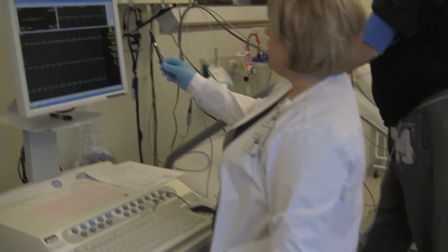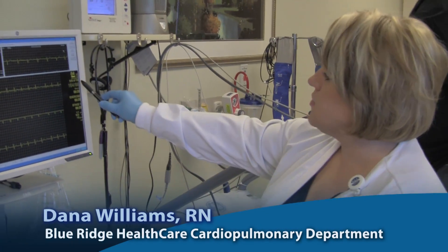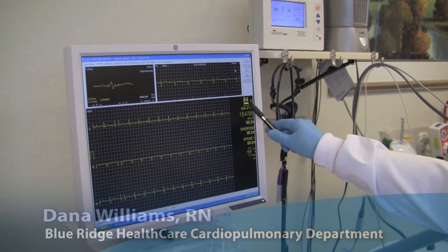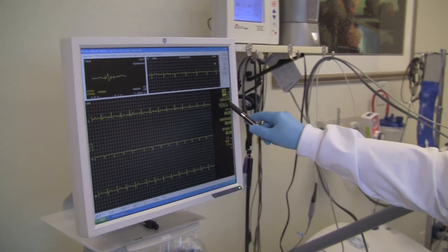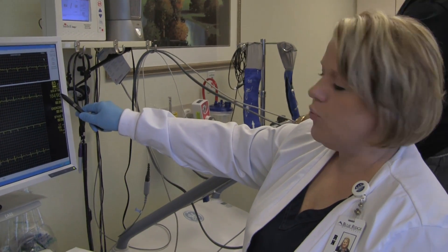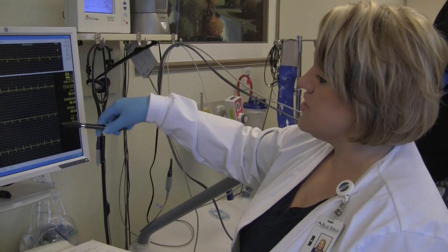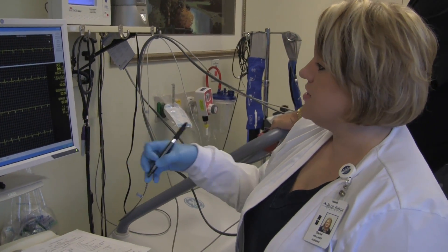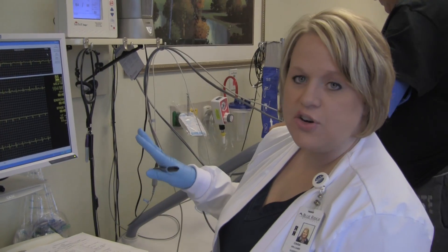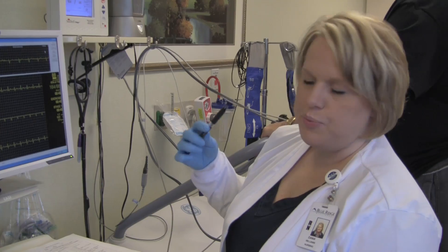Here's how we do a stress test. We take 220 minus the patient's age, and that gives their maximum heart rate of 158. His heart rate right now is 84, so we're currently at 52% towards his 100% goal of 158. We are looking for any rhythm changes that occur during the test, and every three minutes the exercise treadmill will increase in speed and elevation gradually until we get his heart rate up appropriately.